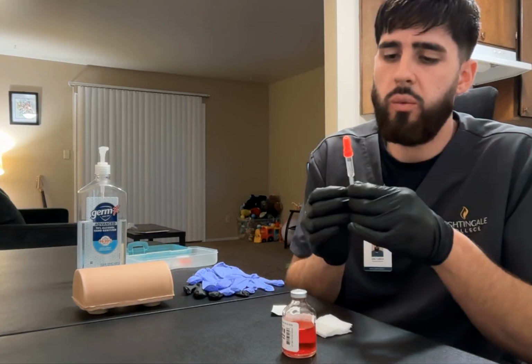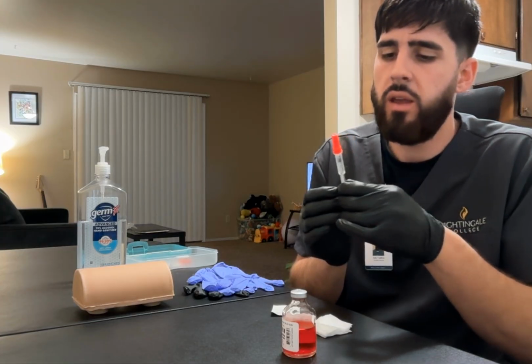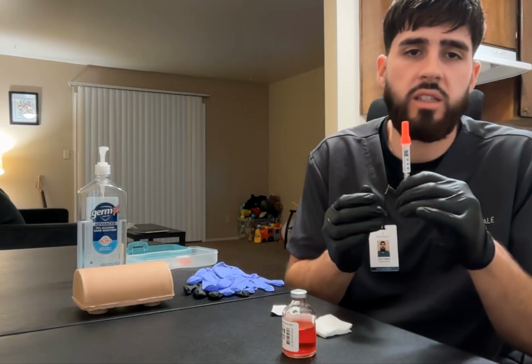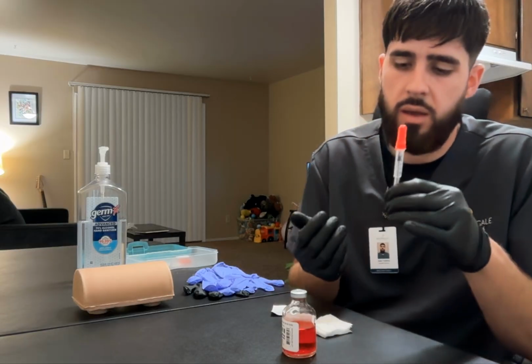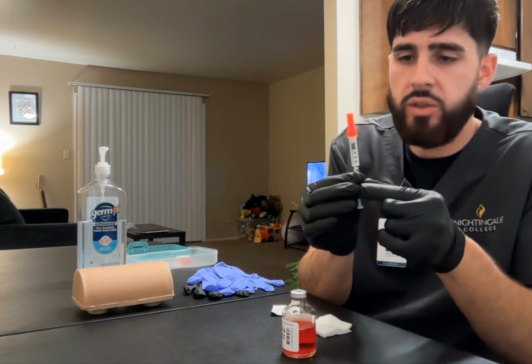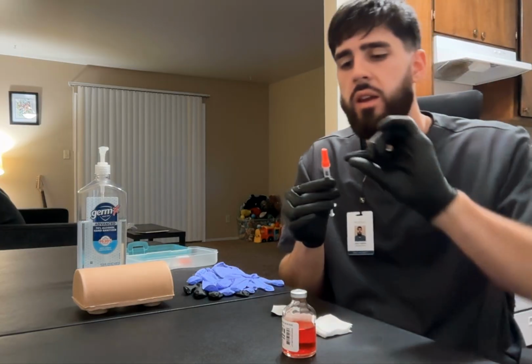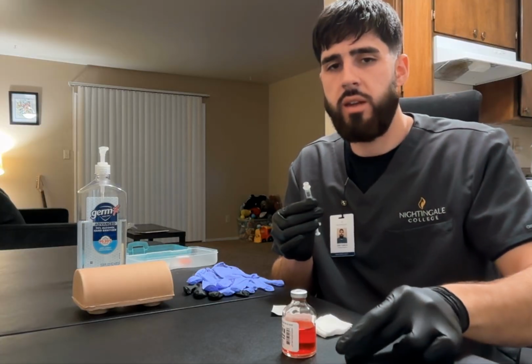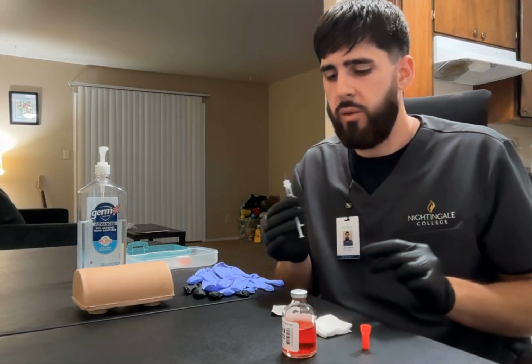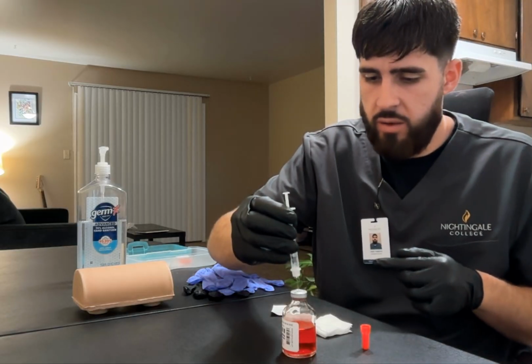Now before I withdraw the medication to the syringe, I need to administer 0.1 ml of air into the actual vial, because that's the amount of medication that I need, and it's going to assist the process of withdrawing the medication. So now that I have 0.1 ml of air in my syringe, I'm going to go ahead and uncap it, set it down on my workspace. I'm going to go ahead and inject the air into the vial.